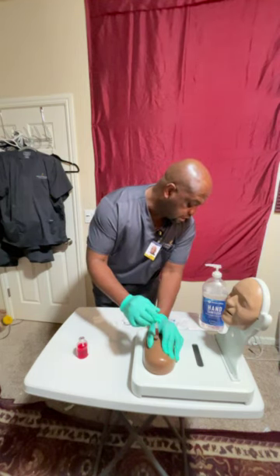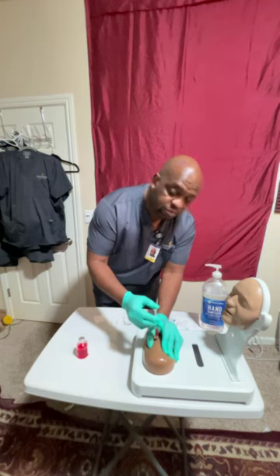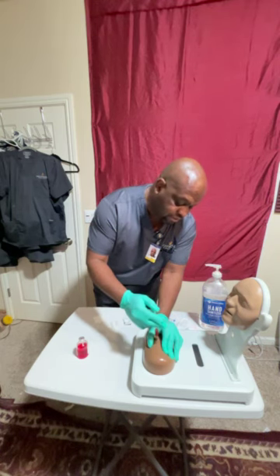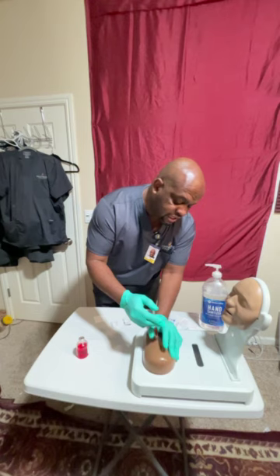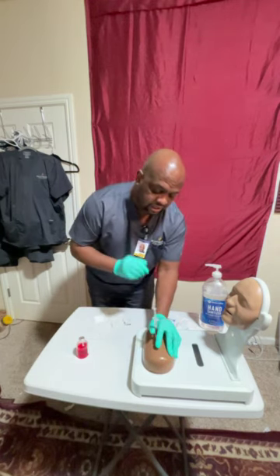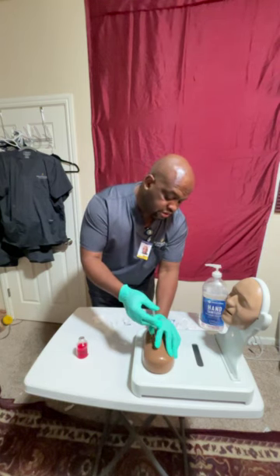Make sure there's no blood that comes back. There's no blood in that syringe. Okay, good. So I am in the right spot. If there was blood, that means I injected it in the wrong area. But yes, no blood, so that means I am right there in the muscle. I am going to use my index finger of my non-dominant hand and my thumb just to secure the syringe. And now I'm going to go ahead and slowly press that in.